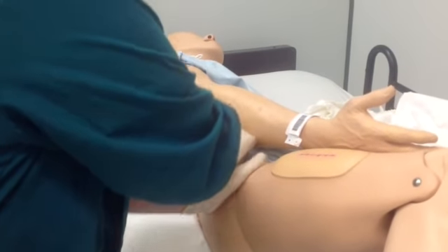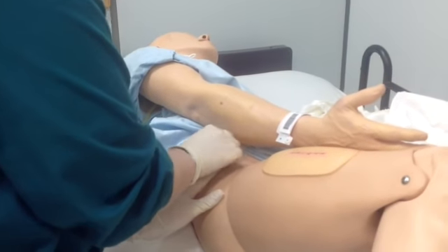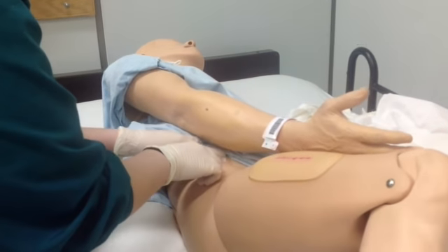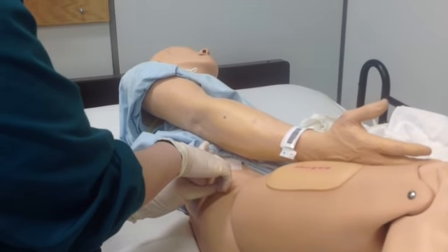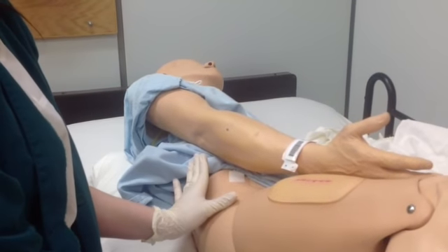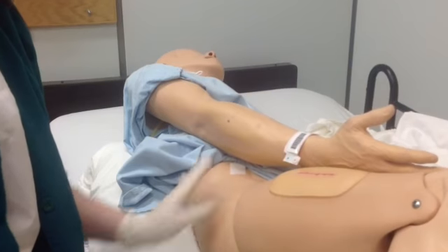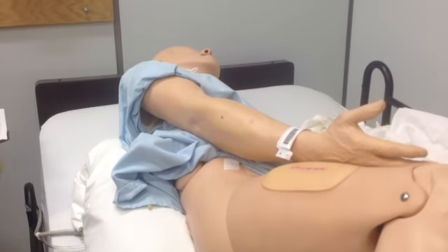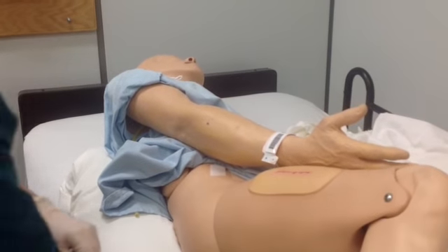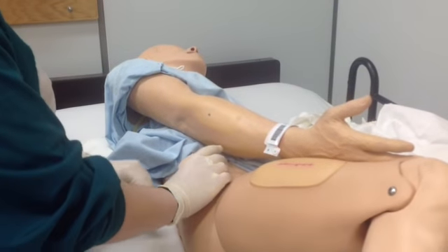So I'm going to clean a little area. And then when you have the area cleaned, you can actually leave your alcohol wipe with a point to the area cleaned. Now, because this is a mannequin, I do not want to stab it, so I'm going to use a fake injection pad, which would be right here.